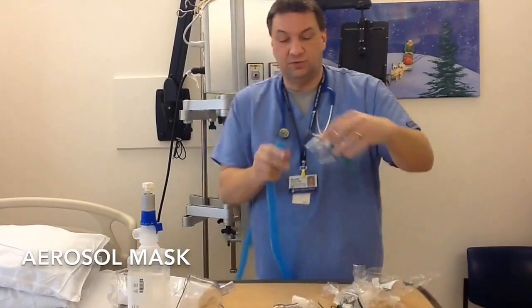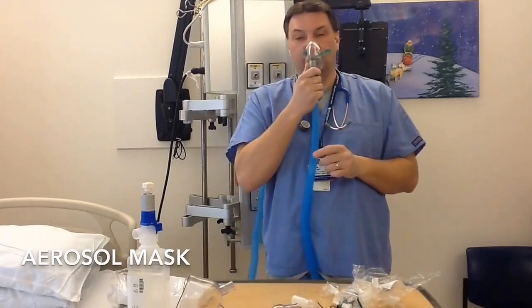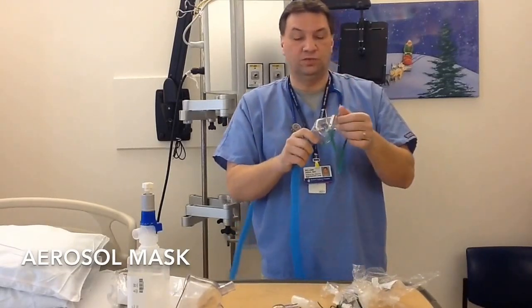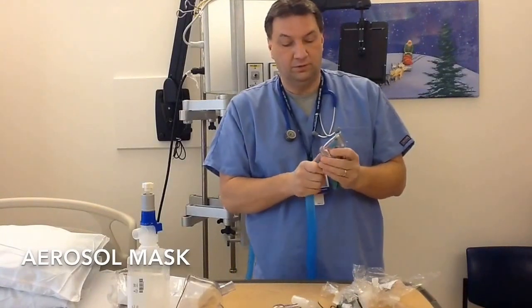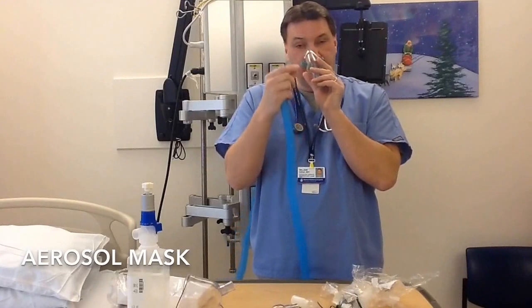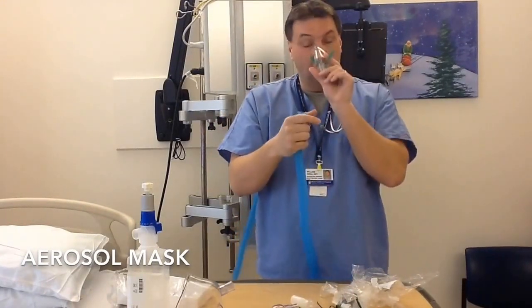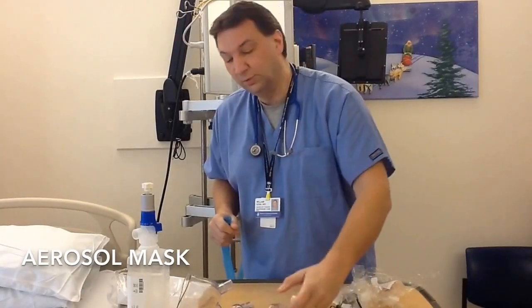Now for the pediatrics, we have a smaller one. Okay, so same exact concept. As long as they're able to tolerate it, put it right over the nose and mouth area, and you're good to go. There's a little silver clip on here. It sits at the bridge of the nose. All you have to do is just pinch that down a little bit once it's on the nose, and that secures it in place a little bit easier, so it doesn't rock back and forth.